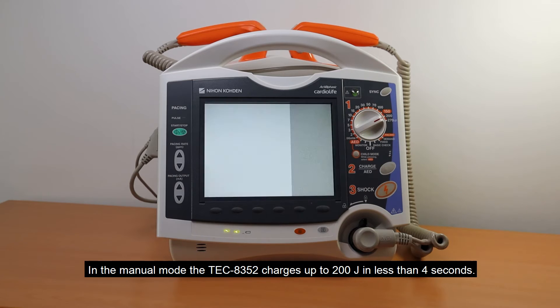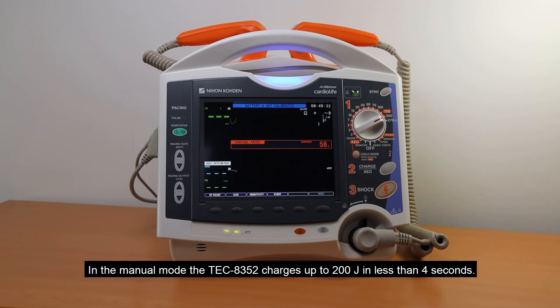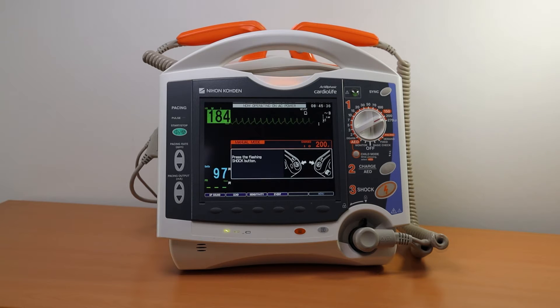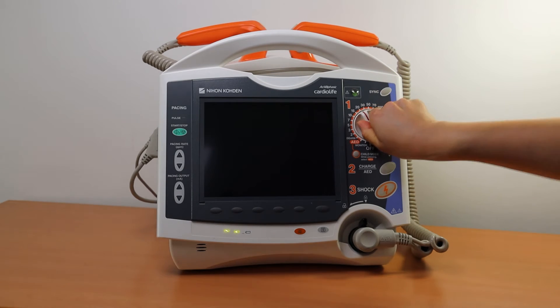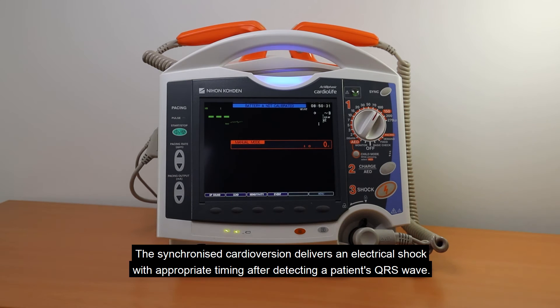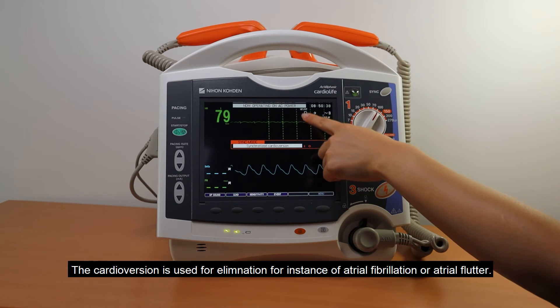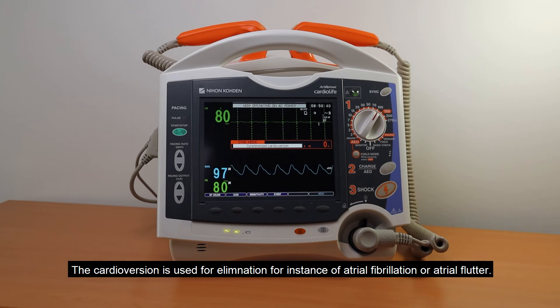In the manual mode, the TEC-8352 charges up to 200 J in less than 4 seconds. The synchronized cardioversion delivers an electrical shock with appropriate timing after detecting the patient's QRS wave. Cardioversion is used for elimination of, for instance, atrial fibrillation or atrial flutter.